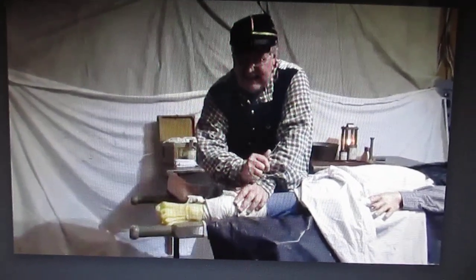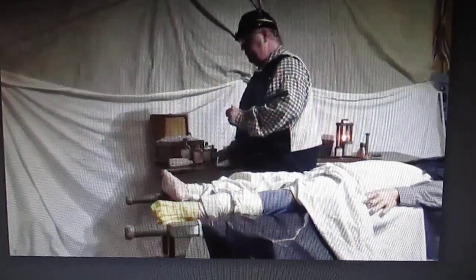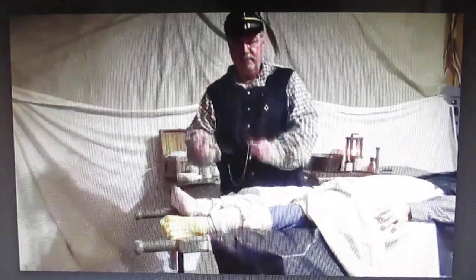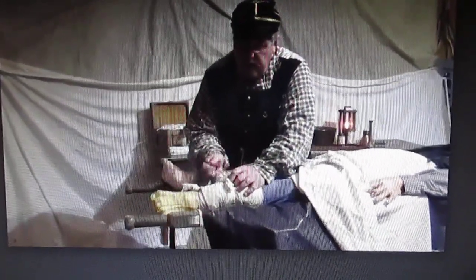So I'm going to put this in there and twist it a little and see if it seems like there's something in here. Oh yeah, we have a mark on it, so we definitely have some type of bullet. The next step is to take a scalpel and usually to open the wound up a little. So I'm going to push the bandage to one side and do a little cutting here. There we go. And I've now opened up that wound.